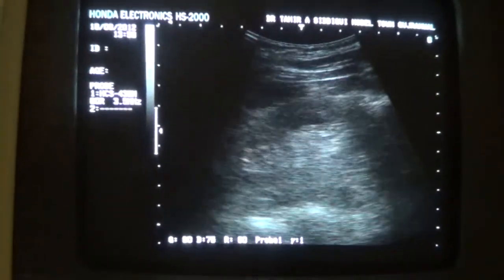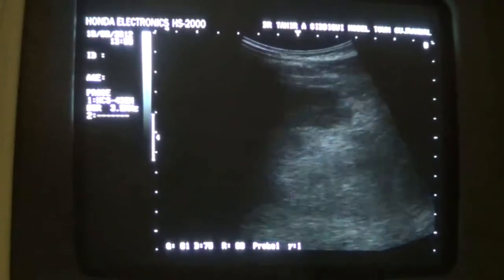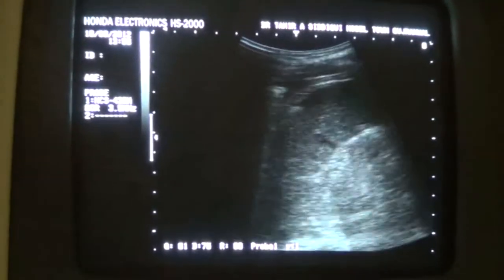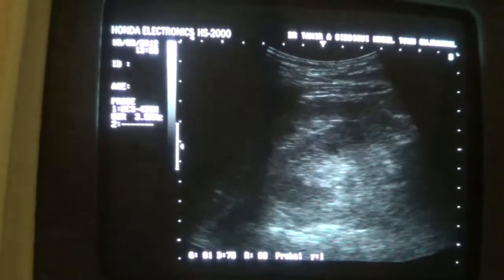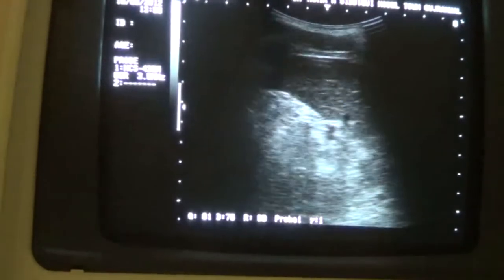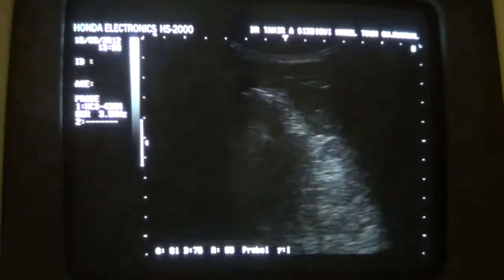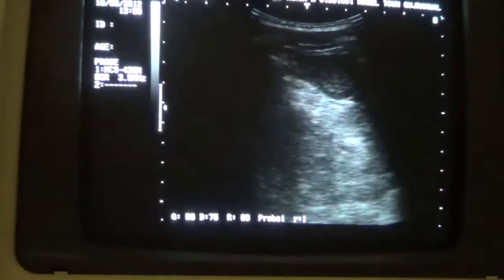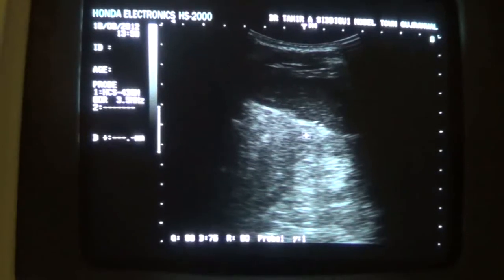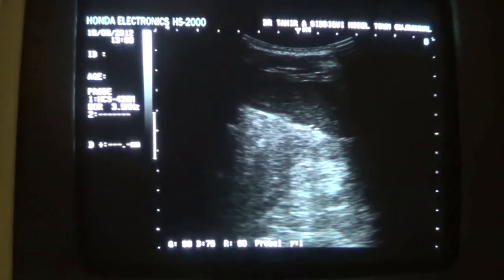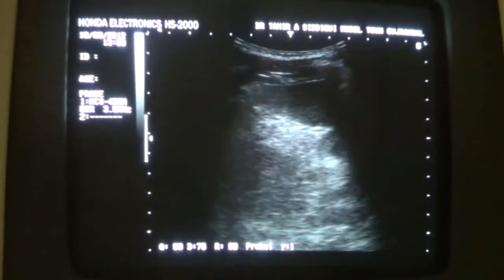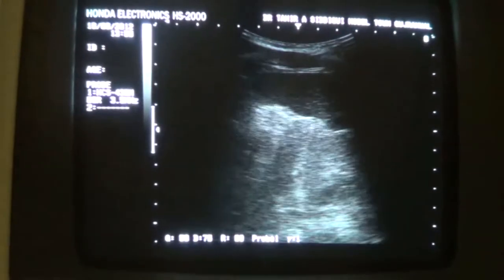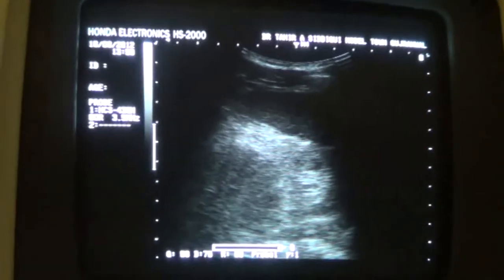So this is how you evaluate medical renal diseases. This is the kidney in transverse section, and here you can see the vessels entering and leaving the hilum of the kidney. This is the transverse section of the left kidney. So in summary: the right kidney shows grade 2 parenchymal changes and the left kidney shows grade 1 parenchymal changes.